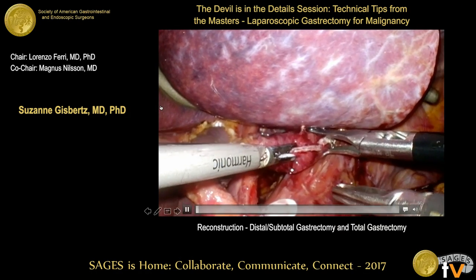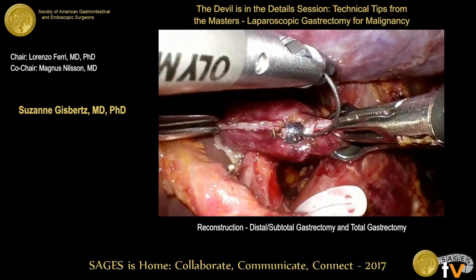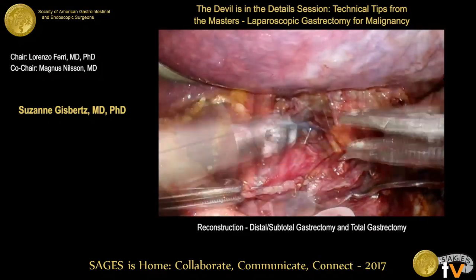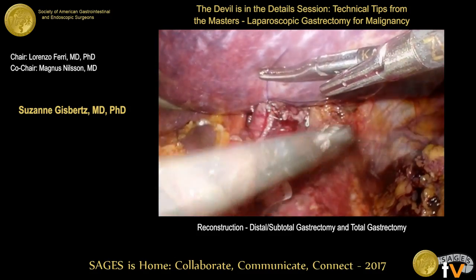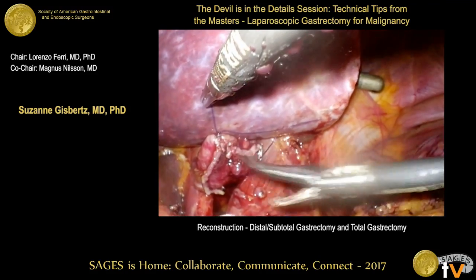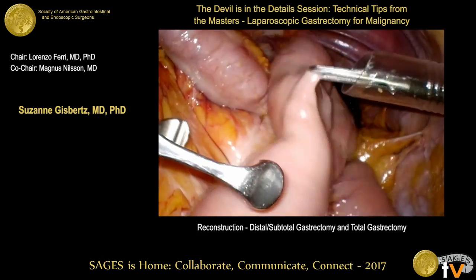The functional end-to-end anastomosis is shown: it's a side-to-side anastomosis where the end of the esophagus and the end of the bowel are aligned. The advantage is that the limiting factor of the small bowel is the mesentery, not the bowel itself — so you can potentially reach a little higher compared to a conventional side-to-side technique.